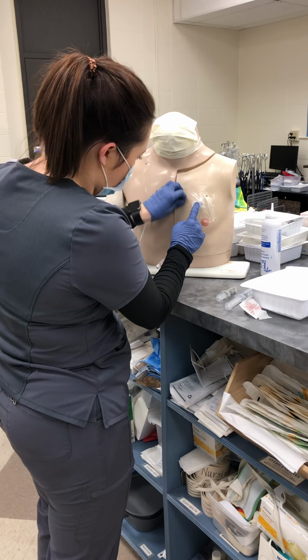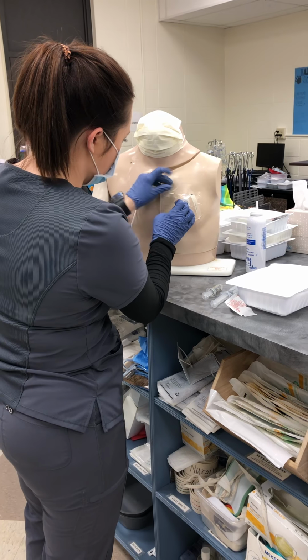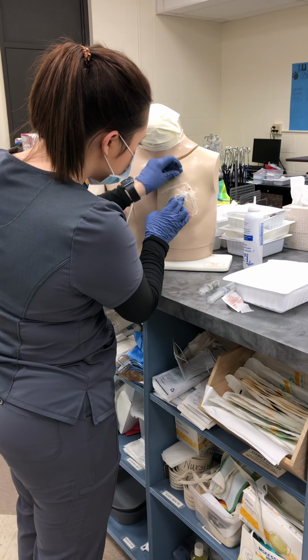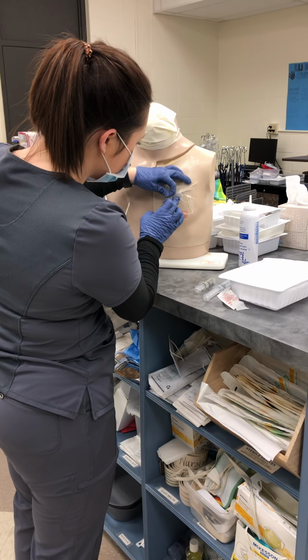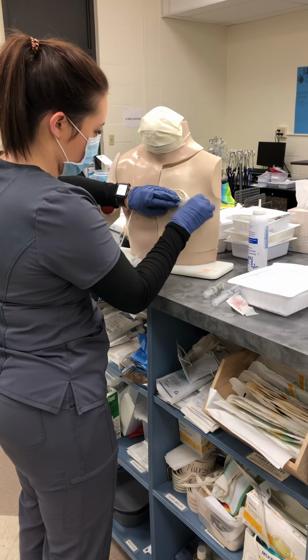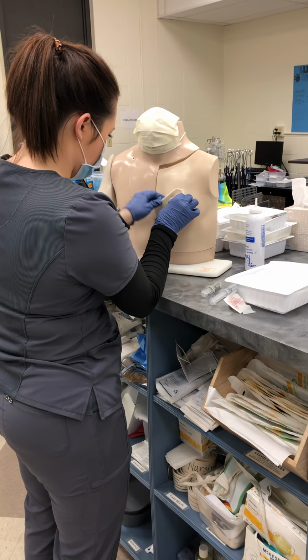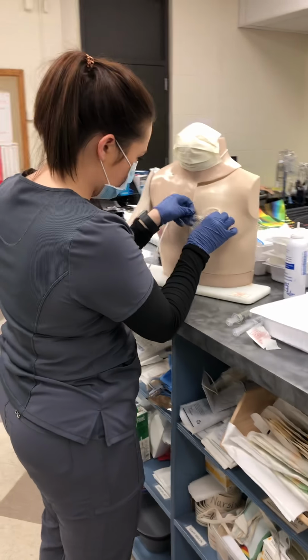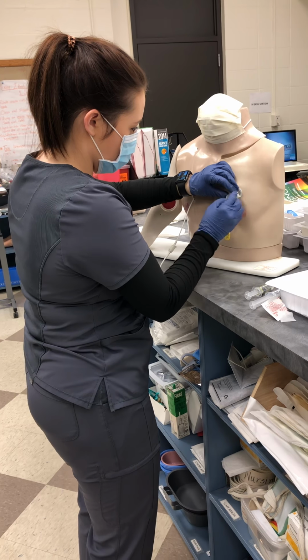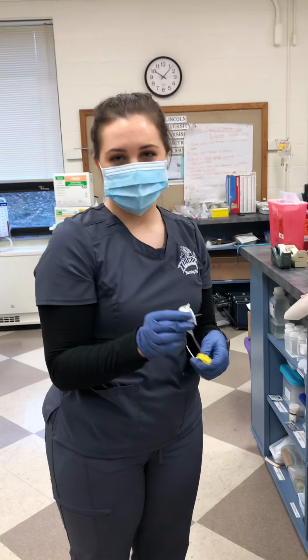So you're going to start from the outside, working your way in, making sure to hold the needle in place so it doesn't get ripped out when you're pulling the dressing off. Okay, and now that the dressing is removed, you can pull the needle straight out, and no dressing is needed, and that's the end of this procedure. Thank you.